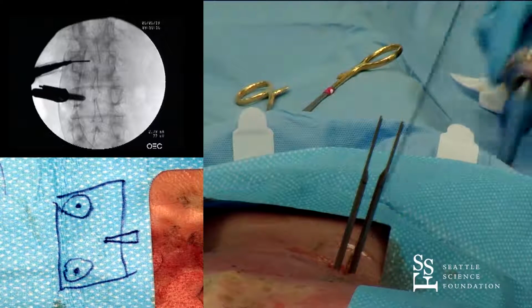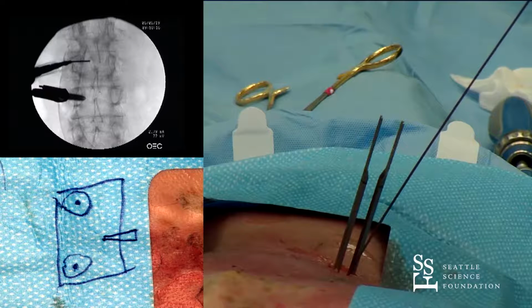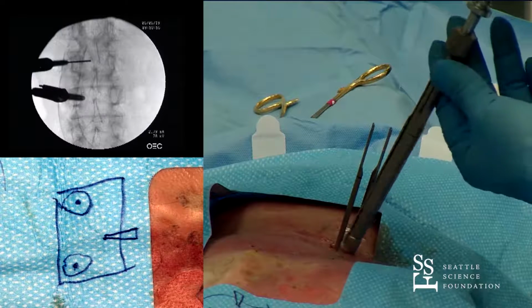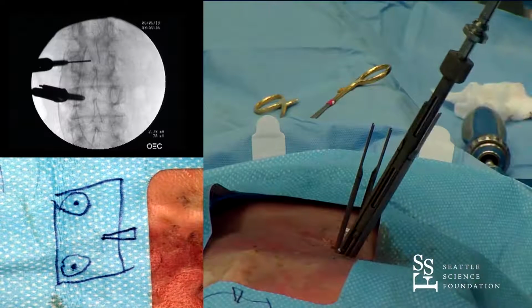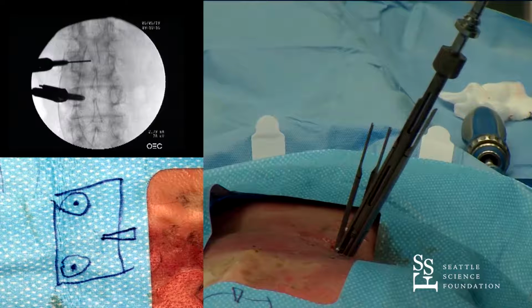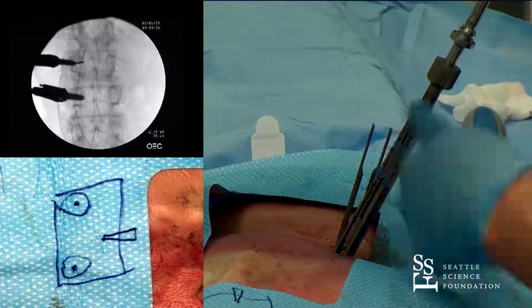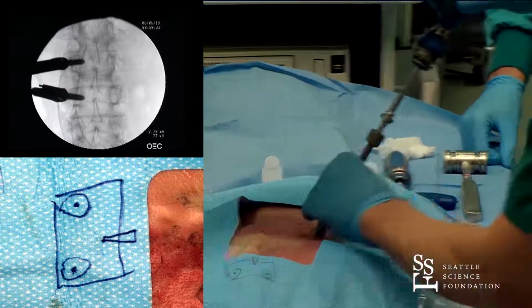Okay, so same thing. Here's a screw. I don't know if you see, but you see this channel? That channel is where we're going to put a rod, and I'll show you a free screw in a second. Shot. Shot? Is it here? Shot. Guide wire comes out. Shot. Good. Okay. Excellent.